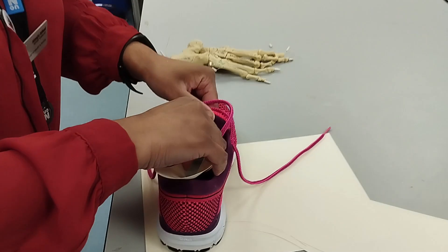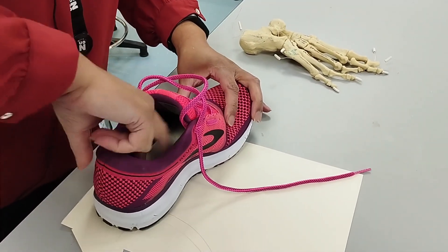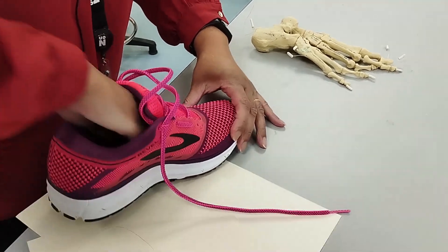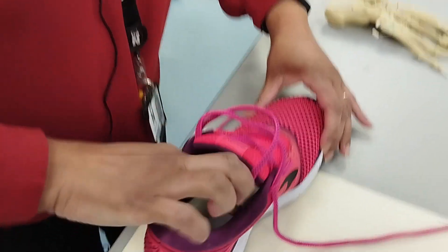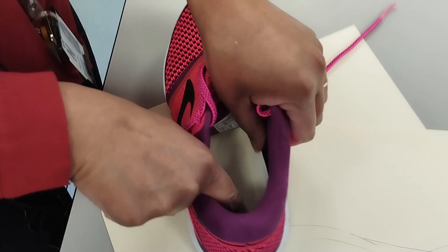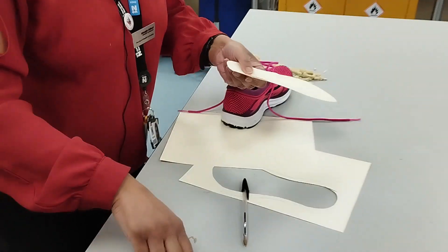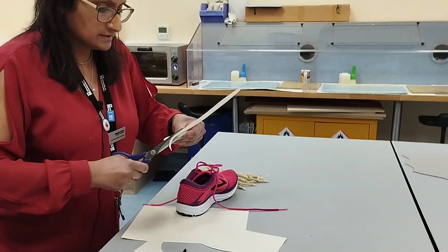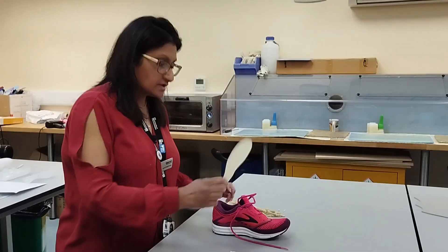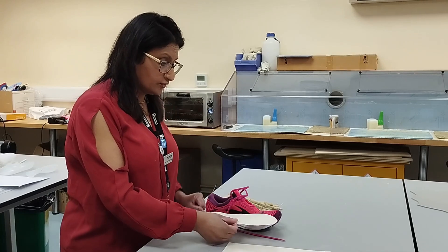You then place the template inside the shoe, push it all the way to the front, push it down, and it fits perfectly all the way to the end of the heel. I can see, however, that the heel is slightly wide inside the trainer, so I just need to trim that down slightly. And then it fits perfectly — the right size template for the length and width of the trainer.